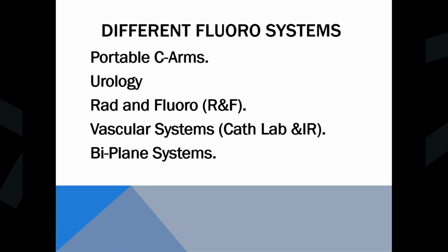The next one would be your vascular systems. That includes your cath labs and IR. And then again, another kind of specialty version of those systems are the biplane systems. And again, you'll find those in interventional radiology and in the cath lab.